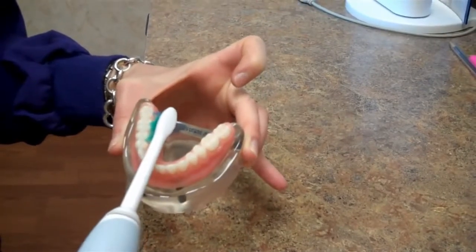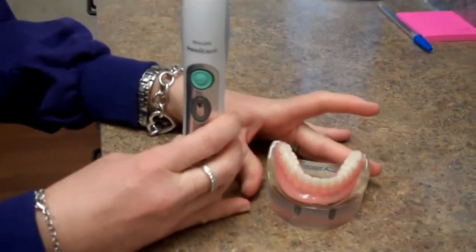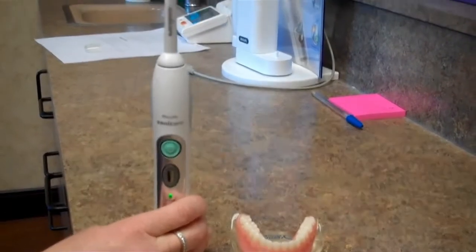You want to use the entire two-minute cycle that the Sonicare offers — it beeps every 30 seconds. In some cases, I recommend using two minutes on the upper teeth and a whole two-minute cycle on the lower teeth.